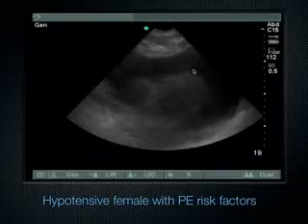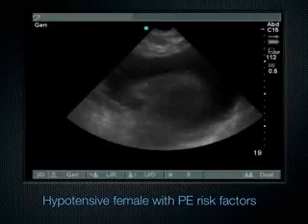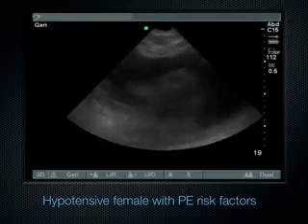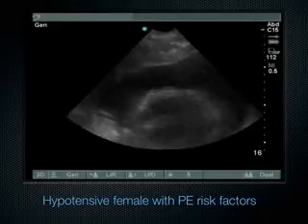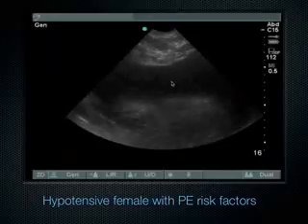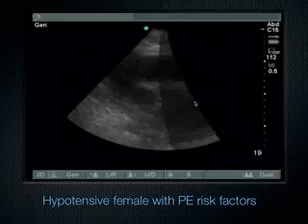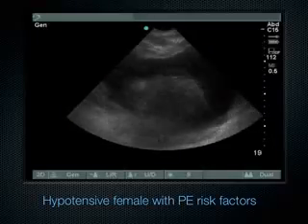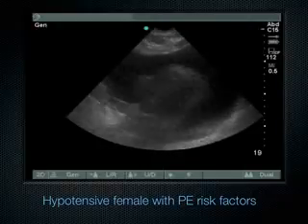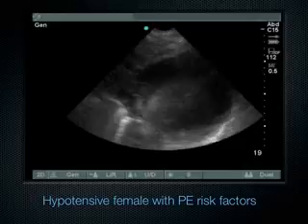In fact, it's tamponade. How do I know? Because the heart is swinging back and forth. And if you did an EKG, you would likely see what? Low voltage EKG, exactly, because of all this fluid here. It's hard for the electrical impulses to make it all the way to the skin line. However, sometimes you get lucky and you see the electrical alternans, and this is why, because the heart swings back and forth. But the most common finding of pericardial tamponade on an EKG is actually low voltage EKG.